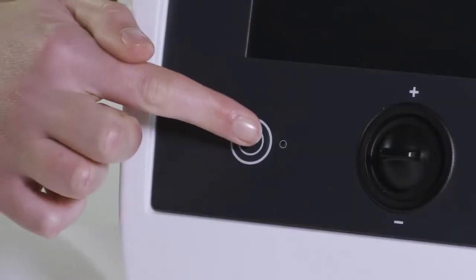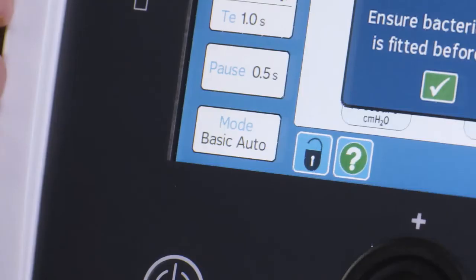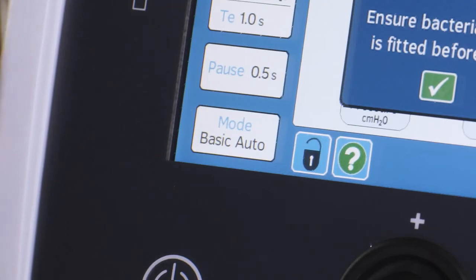Press the power button on the front of the Clearway 2. The device will boot up and be in the same mode as it was when it was last used. If it is a new device, it will be in the default mode.